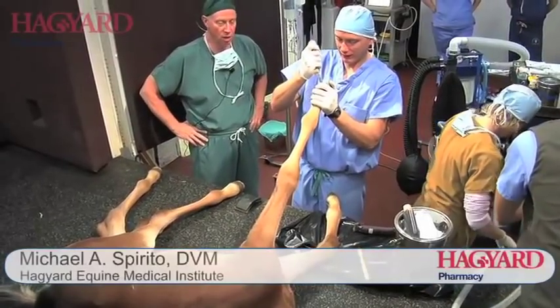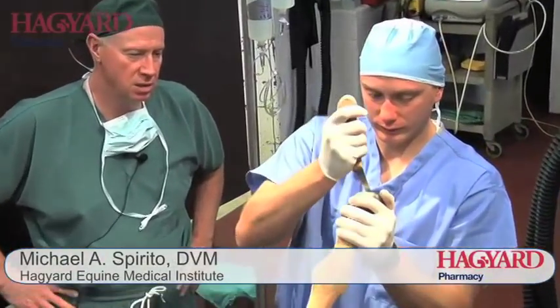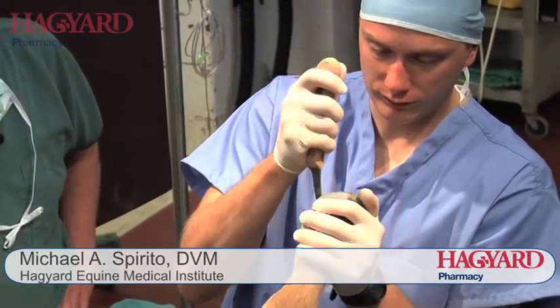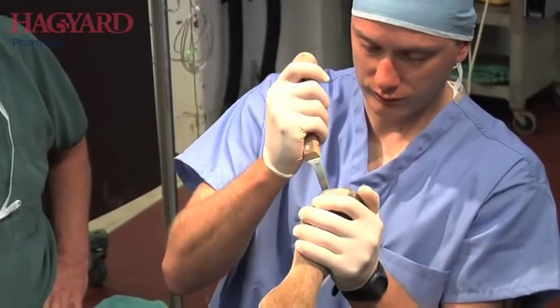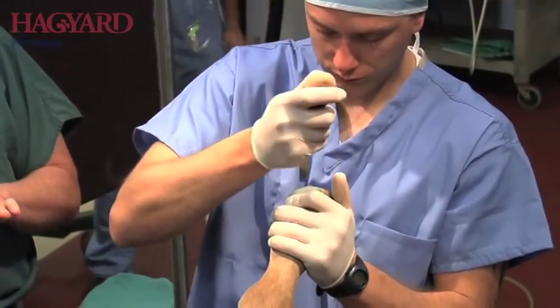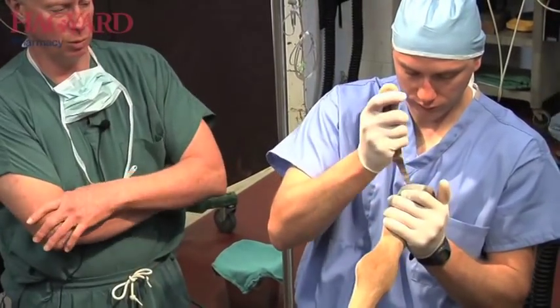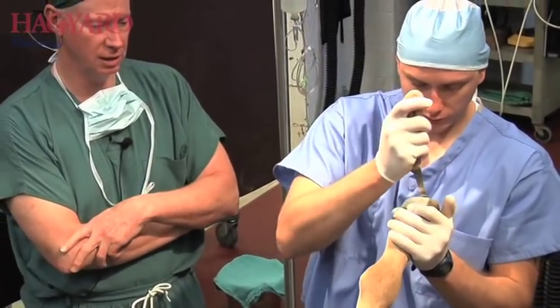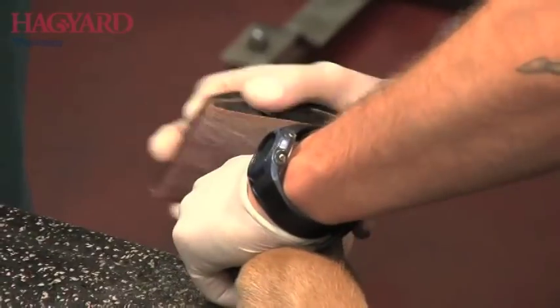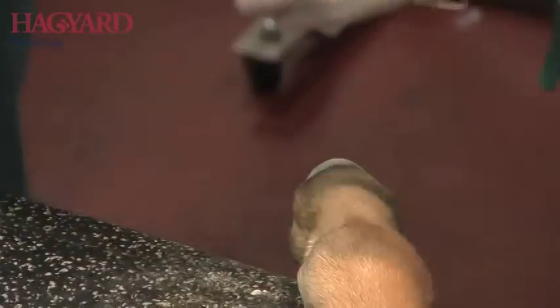What we're doing here is putting Equilox on this foot, which is an acrylic substance that binds with the hoof wall and basically becomes one with the hoof. If it's put on correctly, it'll stay on for up to 45 days. On this age foal, it will help manage the placement of the foot and make his foot go out. We're putting Equilox on the outside of the foot, and we need to make sure the foot is clean and the hoof wall is sandpapered down to create fine micro grooves that the Equilox will bind to.